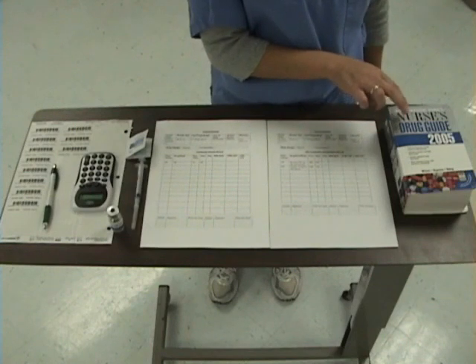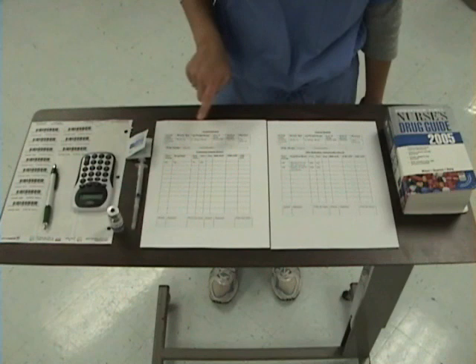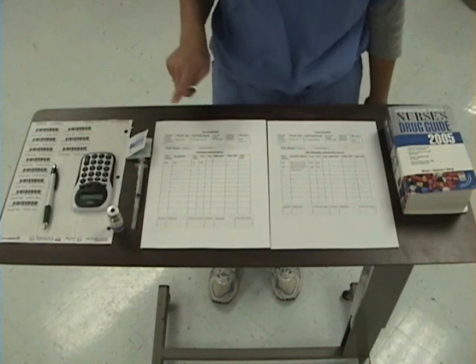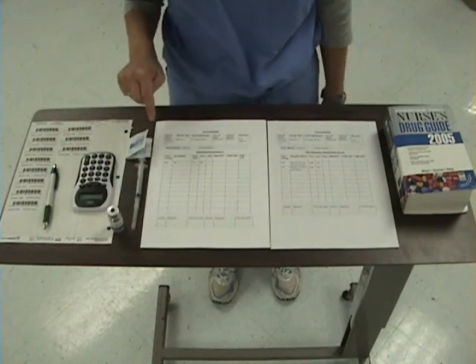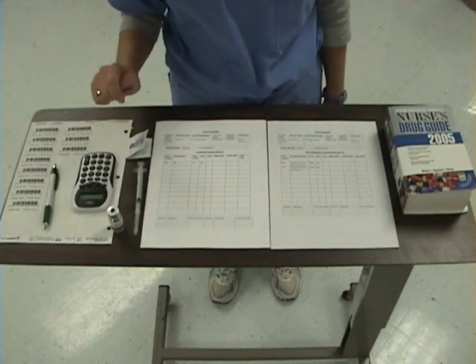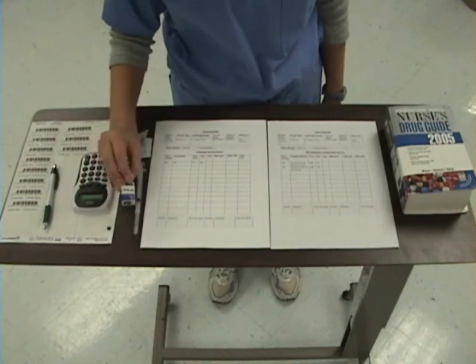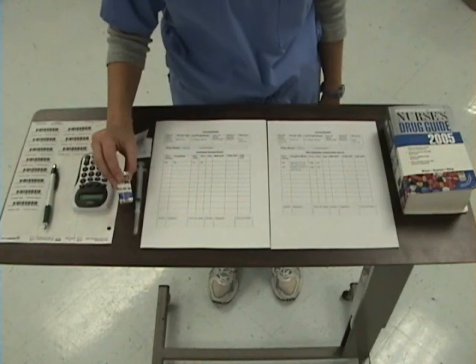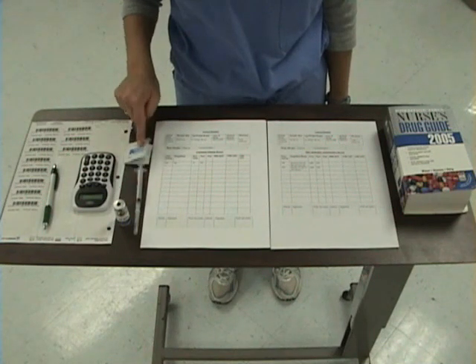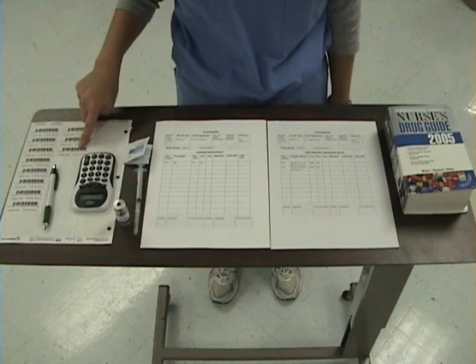For this, I need a drug book, my medication record, or MAR, my continuous infusion record that has my IV fluids, a syringe with either a needle or a needleless device to draw from a vial. I need my medication, which is the Reglan, alcohol preps, a calculator, a pen, and patient labels.